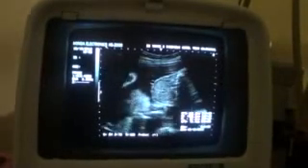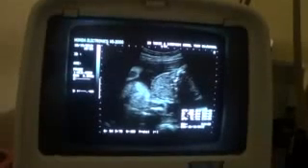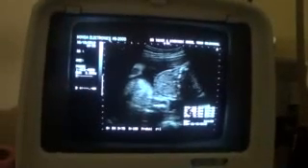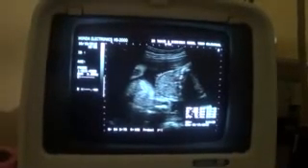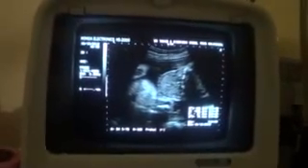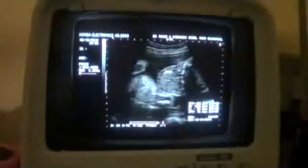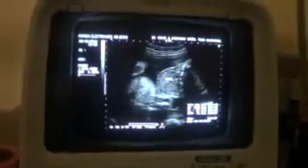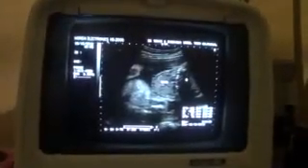Its covering suggests that this is the head, this is the brain. So now this is the covering, and this is an evenly echogenic mass relating to the fetal neck and neck region, that too anteriorly. The mass is anterior to the neck. This is the head, fetal head.